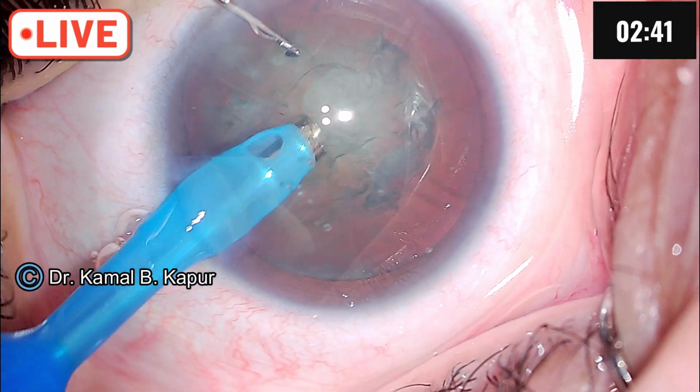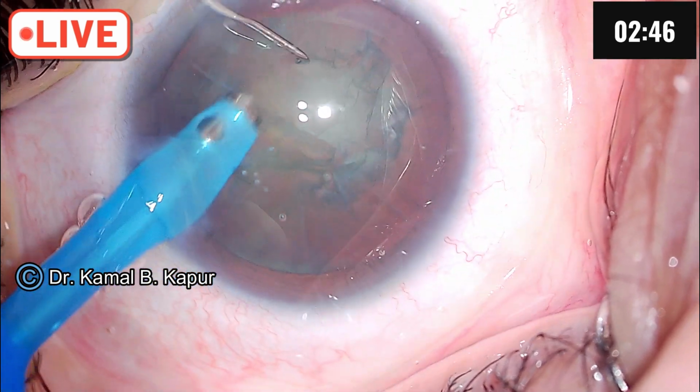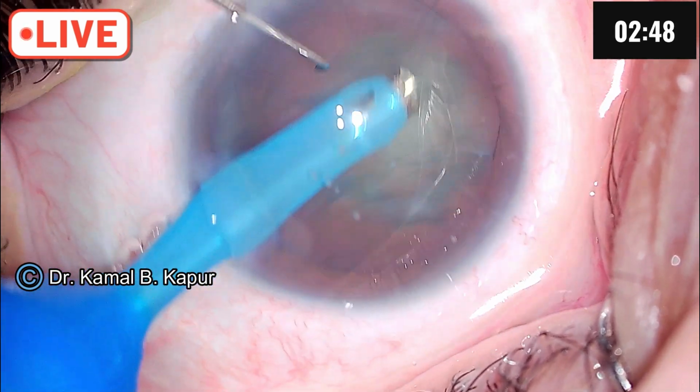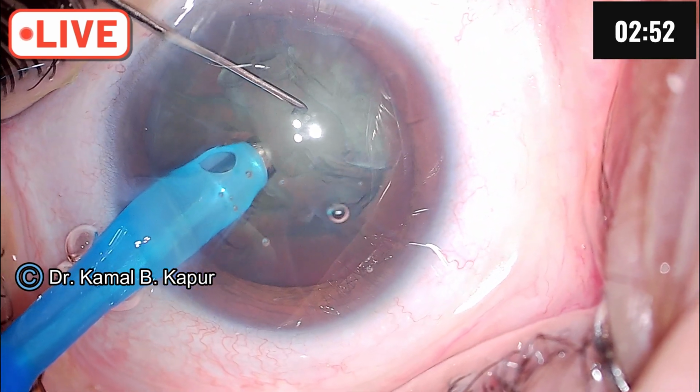If you notice, I made a slightly larger side port, and I'll keep my side port dipped so as to cause enough leak so that there is no build-up of pressure.